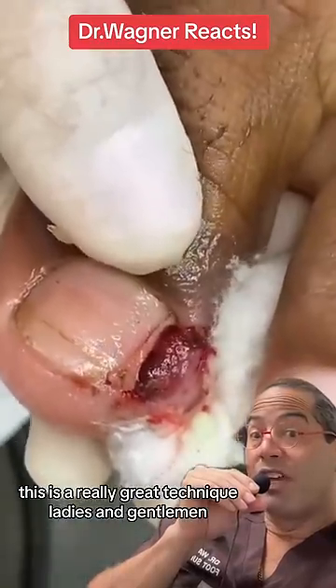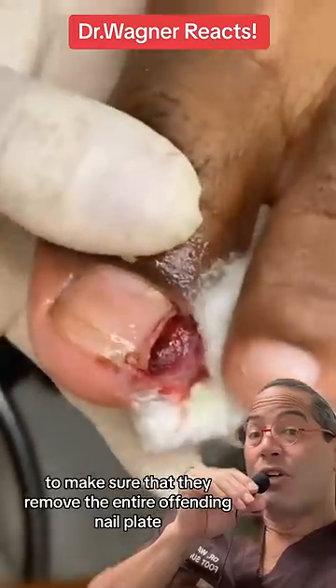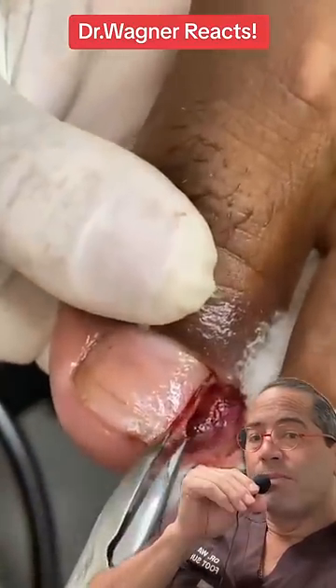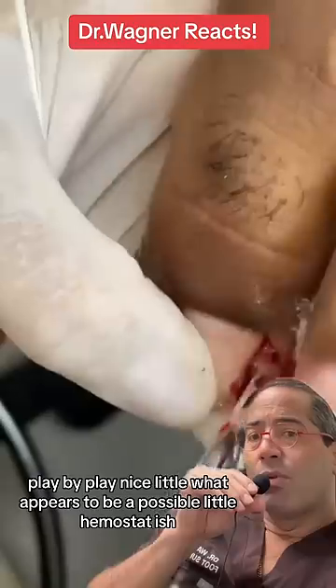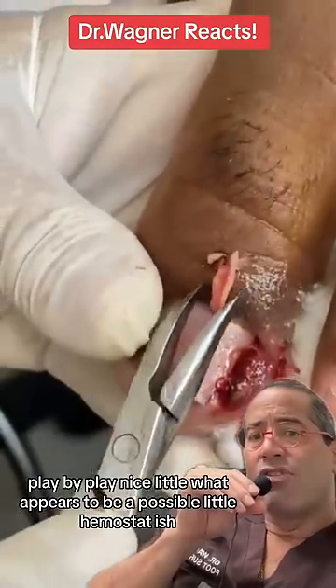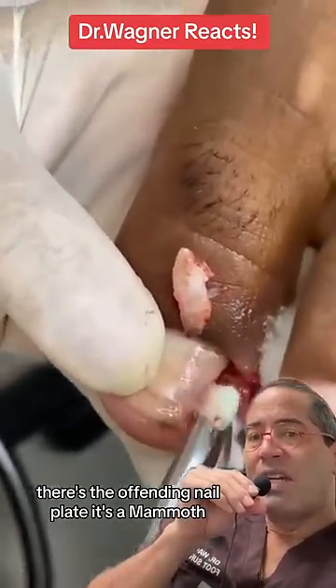This is a really great technique, ladies and gentlemen, to make sure that they remove the entire offending nail plate. Play-by-play — there appears to be a possible little hemostat, and there's the offending nail plate. It's a mammoth.